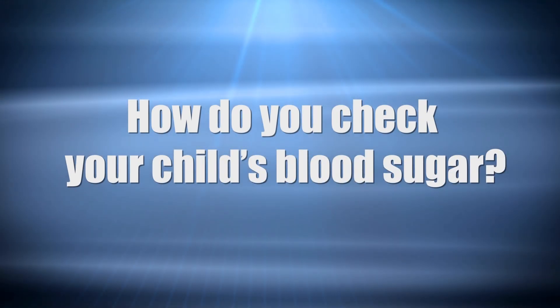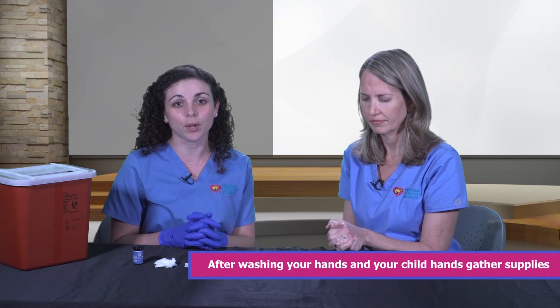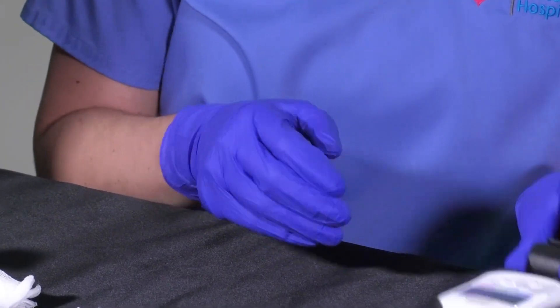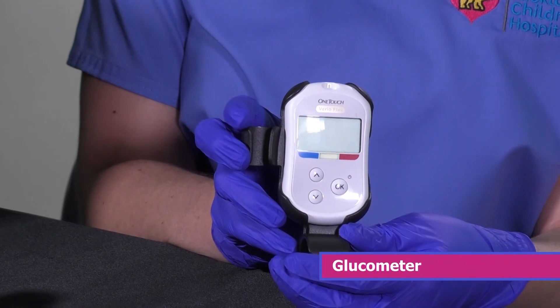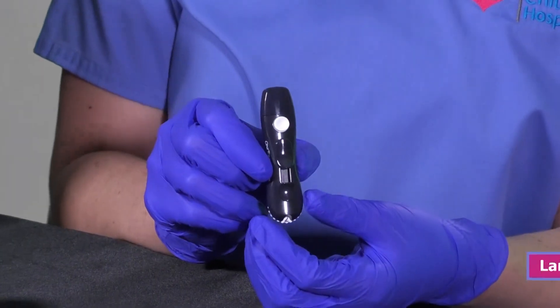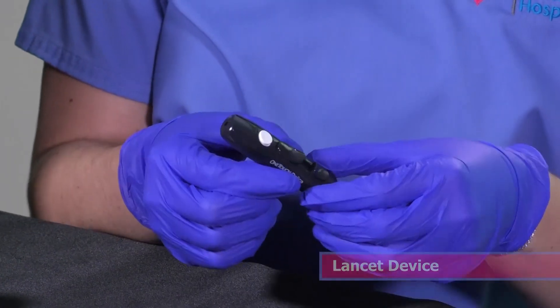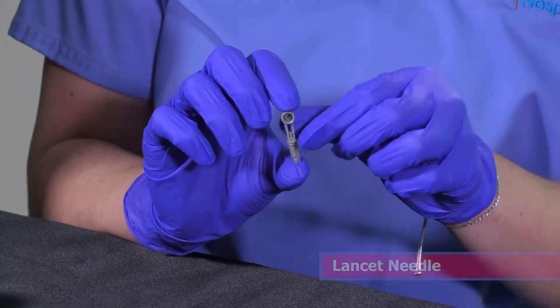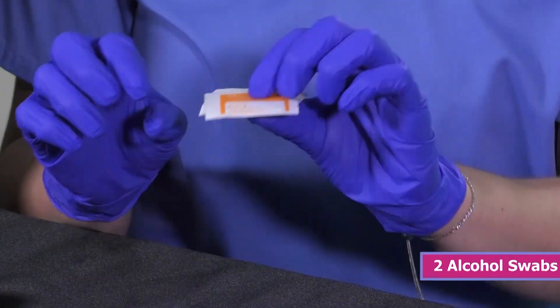Now we are going to demonstrate how to check your child's blood sugar. First, you're going to wash your and your child's hands. In the hospital setting we wear gloves, but it is not needed at home. Next, you're going to gather the supplies that you need: your glucometer, your lancet device, your lancet needle, alcohol in case you're in a public place and cannot wash your hands, gauze, and test strips.